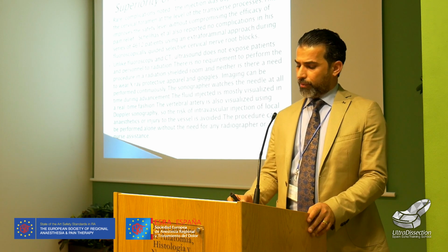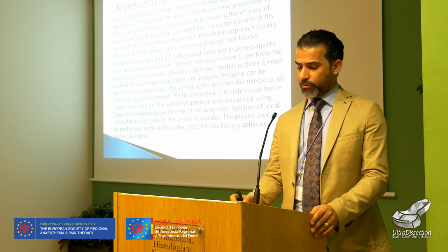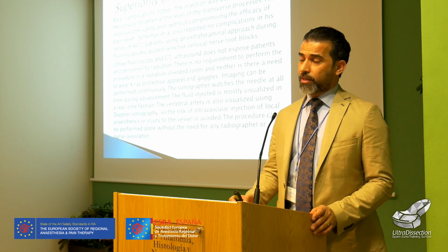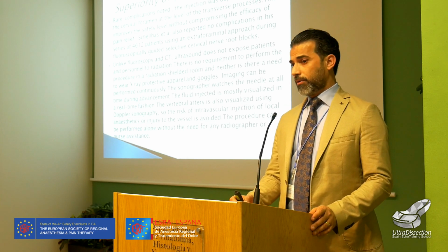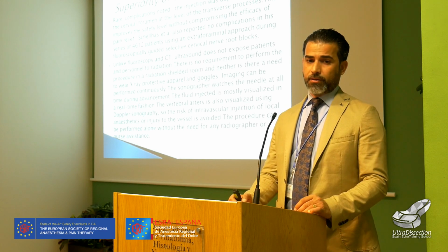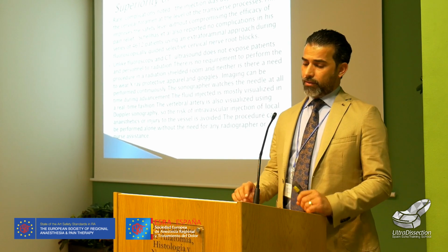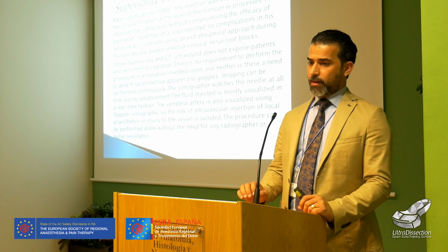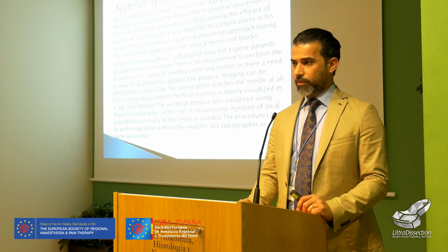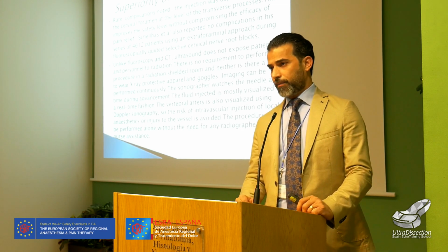Shea et al. also reported no complications with CT or fluoroscope extraforaminal injection. So this is the same here. This is the main idea: to put the local anesthetic or the steroid or any injectate just extraforaminal, not intraforaminal or transforaminal. This is the guide to put the needle extraforaminally, just lateral to the transverse process and the posterior tubercle, and then you can inject, hydrodissect, or modulate by pulsed radiofrequency.